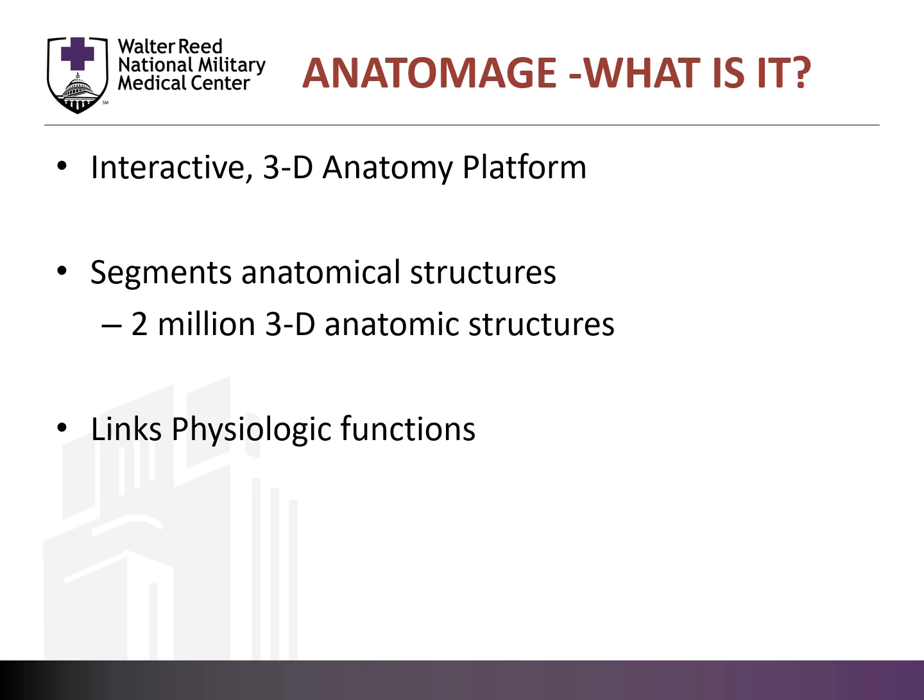The Anatomage Table is an interactive, three-dimensional anatomy and virtual dissection platform. It brings the clinical and simulation worlds together. The Anatomage platform bridges anatomical structures with their physiologic functions.